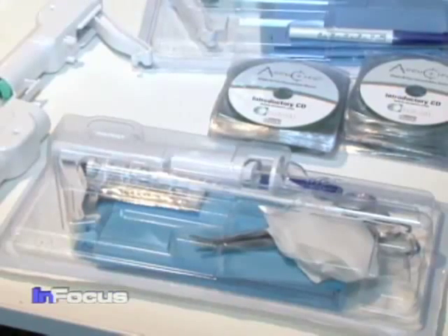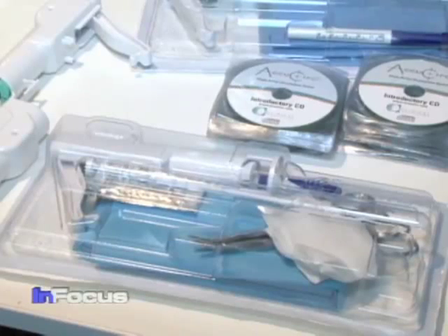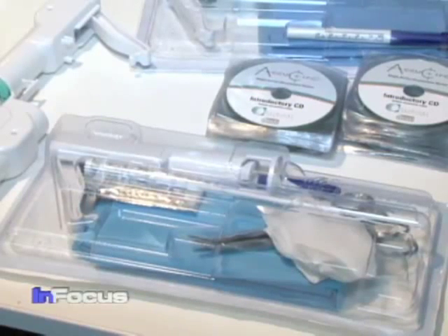The one advantage for Africa in particular is that all the contaminated parts are protected so they can't injure somebody else. The device is destroyed, so there's no chance this could be reused on another infant. And so we really think the device will not only protect children during the procedure, but will protect other children after the procedure by not allowing them to use the contaminated instruments.